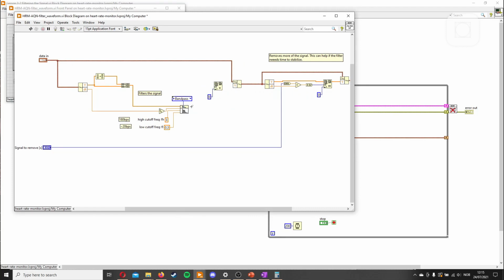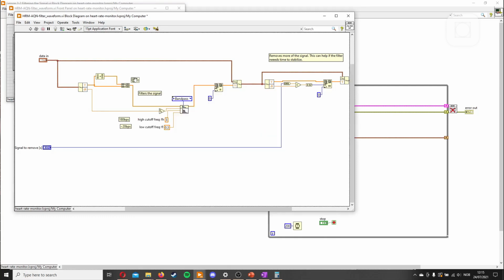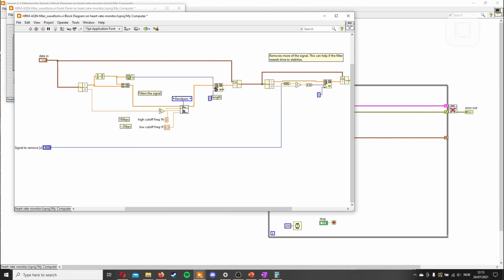Boom. Put this in here, there. And to decide the size we want to remove, we'll just take the size of the array, which is here. Array size. Because then we just remove half of the array, which is exactly what we want to do. And this way, we will get less noise. The maximum we have is 180 beats per minute.